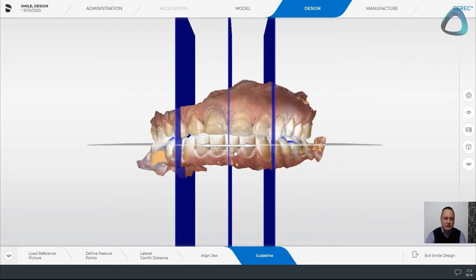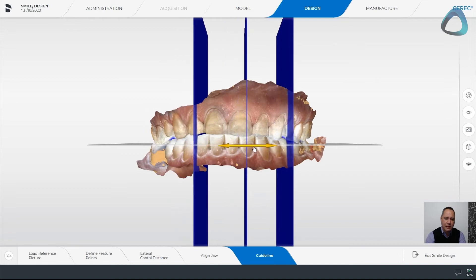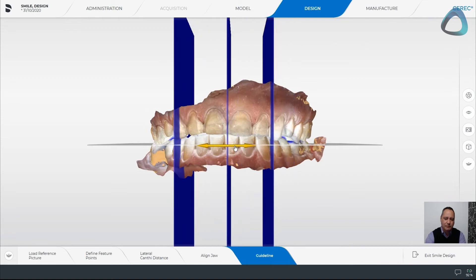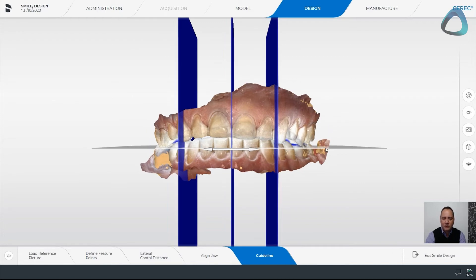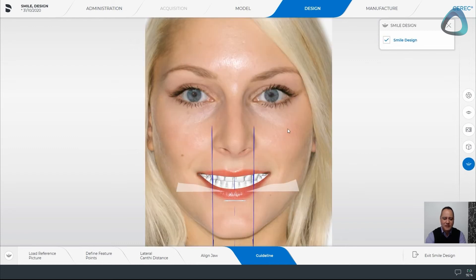We've now got guide planes. We can focus on the midline guide plane, which is quite nice because it gives us a proper midline guide. We've got our two other planes and guides as well. We've now set this up — we can recreate all these different lines — but for now we're going back into smile design to make sure we've got our tick. This brings our photo in with the lines, and you can see the lines on the midlines and the profiles of where it's sitting through the middle.